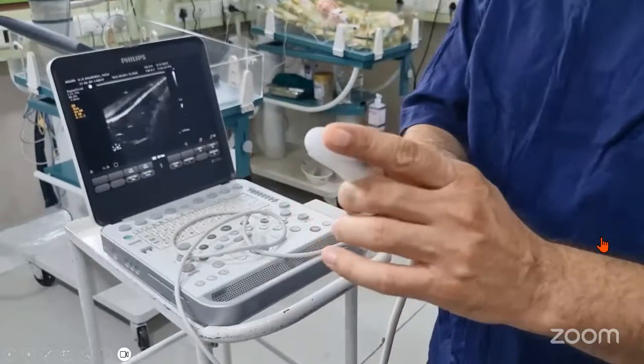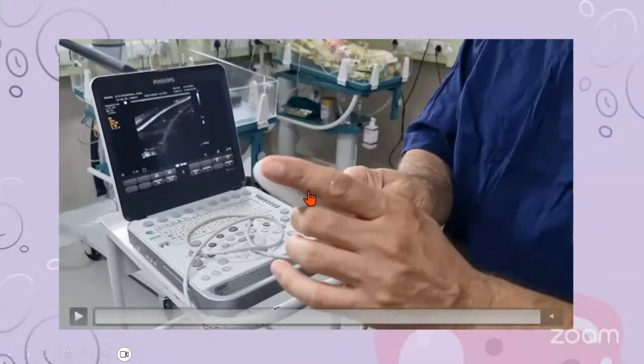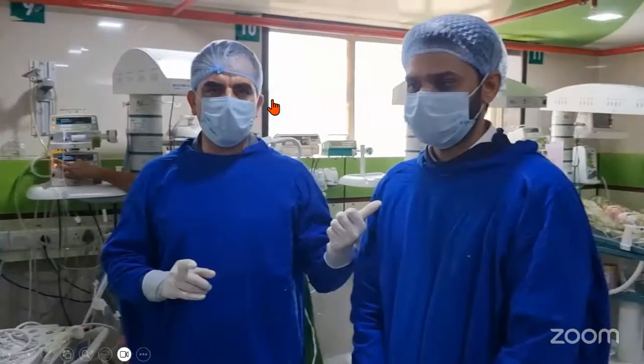The only thing you need to say is, here you see this hyperechoic line. So this is the layer, the rubber layer of the glove. You should be aware of this. This is a kind of artifact, and you should not get it confused with anything in the baby's body.